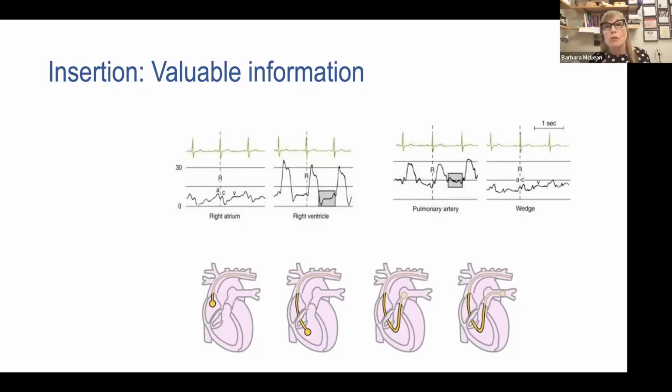Now, I can't take the pulse of your PA, but it's a pulsatile pressure. And the thing that makes it pulsatile is the rapid ventricular ejection and the response of the arteries to the blood that has entered them.